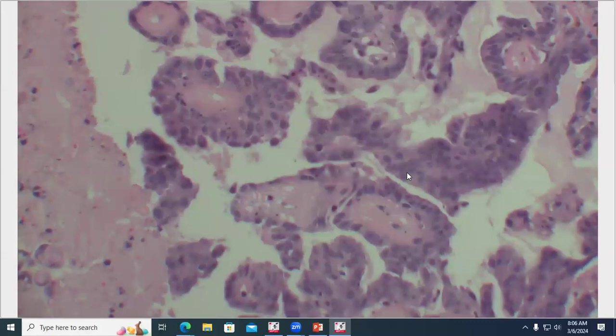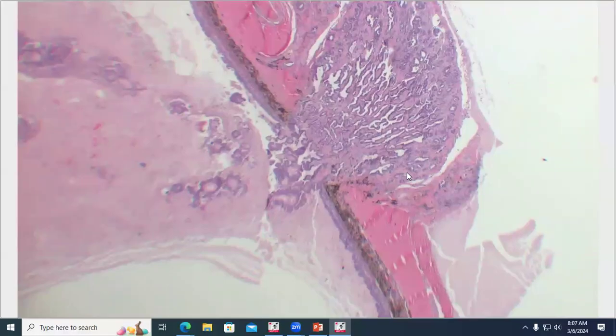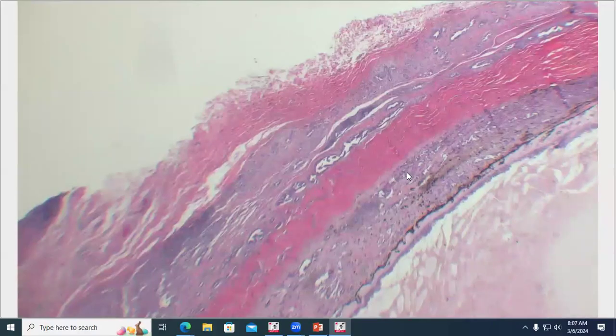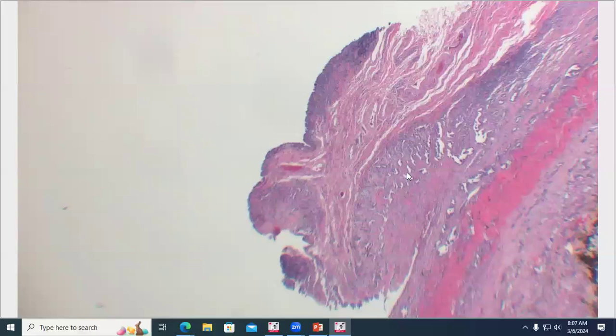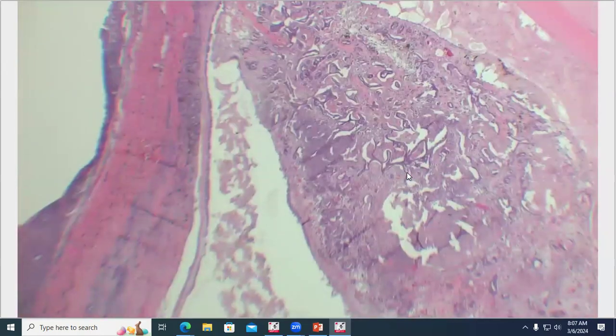I was going to give you another gander at higher power of these neoplastic cells. Anyway, so what we're seeing here is an extensive epithelial neoplasm that is basically infiltrating and effacing the entire uvea, the retina, and the optic nerve of this eye. It also does extend out through the limbal sclera, and it's occupying the episclera on this side of the eye. It is also carpeting surfaces in this eye.